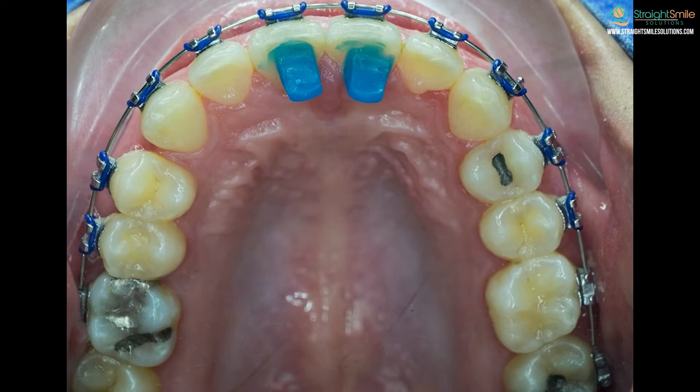If you get bite bumps on your back teeth, it's not quite as challenging to get used to — you can still eat, but you can't bite with your front teeth in that case. So either way it can be challenging.